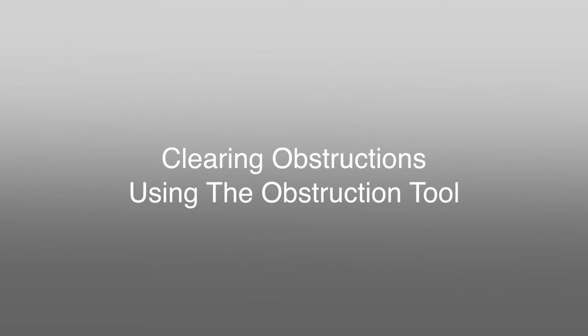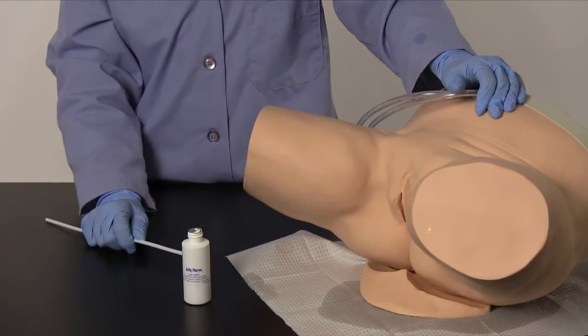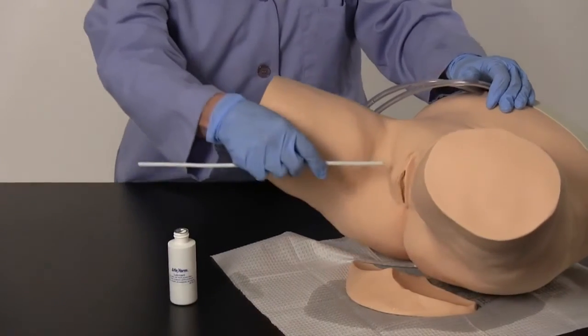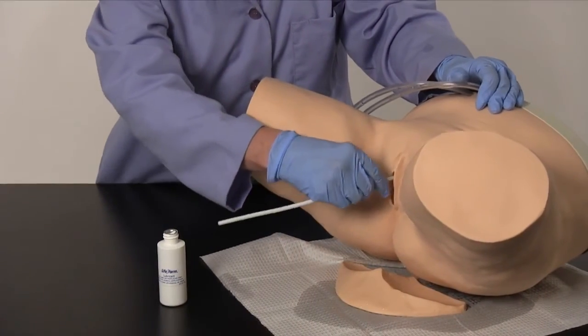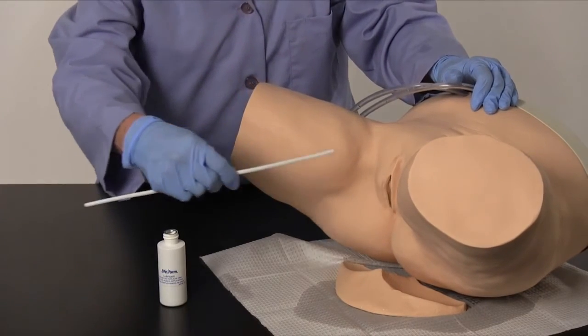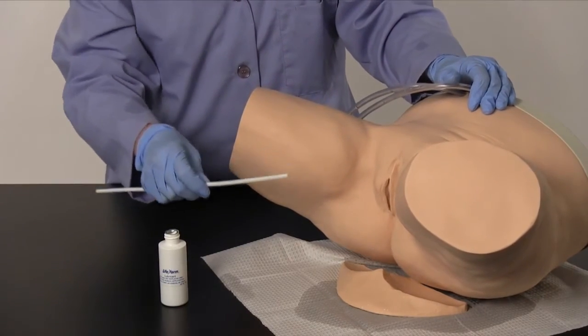Clearing obstructions using the obstruction tool. Generously lubricate the obstruction tool. Follow the catheterization procedures and insert the obstruction tool into the urethra and through the simulated sphincter until you feel the pop and enter the bladder. Follow this procedure by flushing the system with warm water.